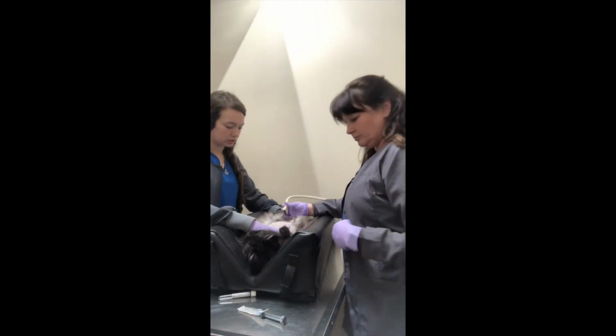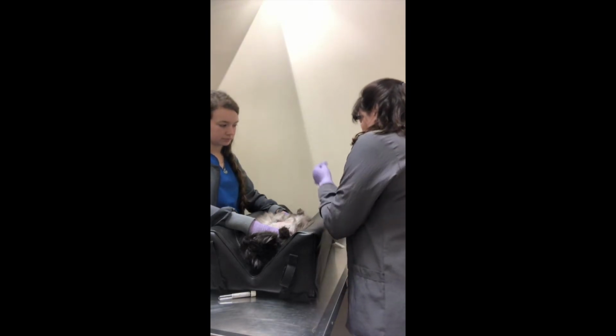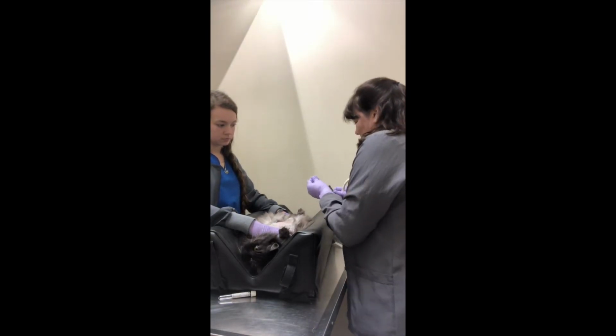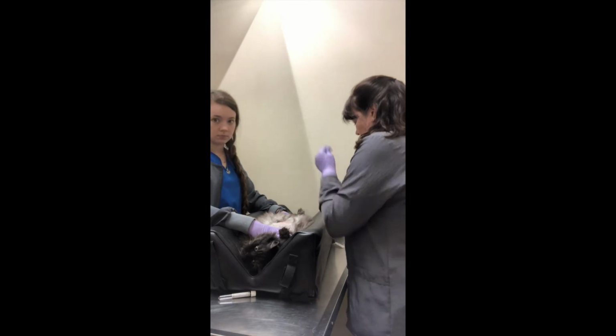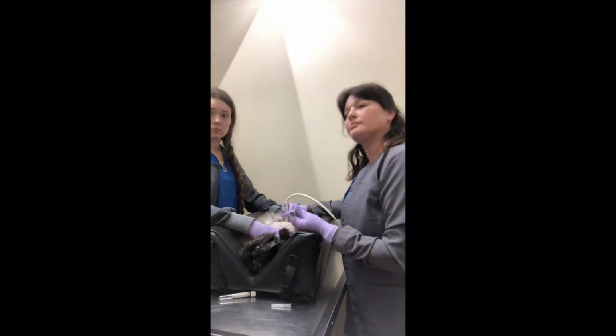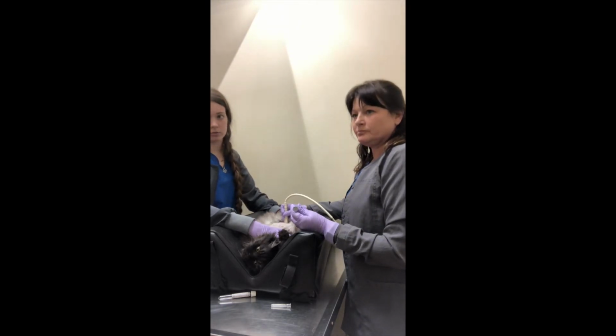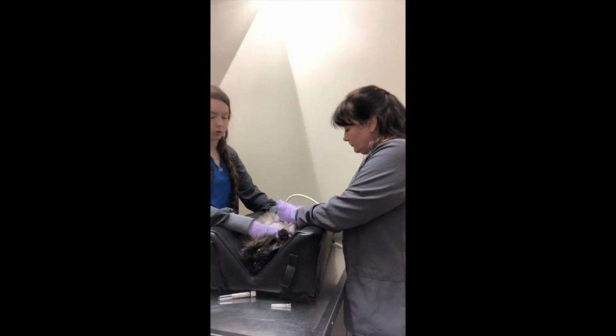And Candace is going to be performing the cystocentesis, and we have a 22 gauge 1.5 inch needle on a syringe here that's sterile. And she's located the bladder on the ultrasound, so she's going to insert the needle at a 45-degree angle.